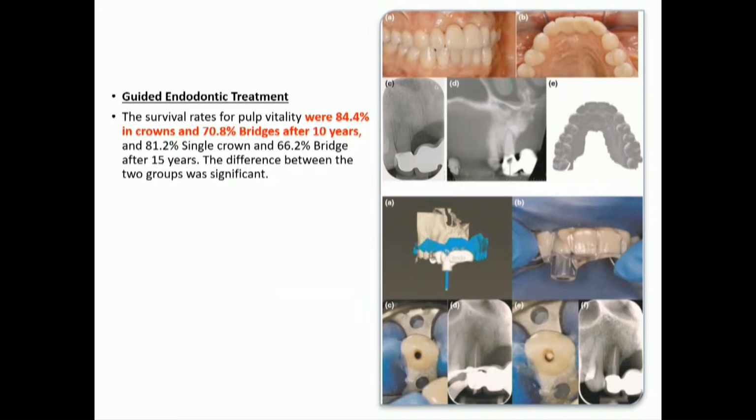And in this case, a nice case that I found as a case report in the literature, a patient had a wonderful bridge. They didn't want to replace the bridge. But I know guys in endo don't really like to drill when there is a bridge because the anatomy might differ. So what they did is they combined the CBCT with the intraoral impression or scan, and they fabricated a drilling guide for their access hole. So imagine how accurate this is. This is quite accurate.